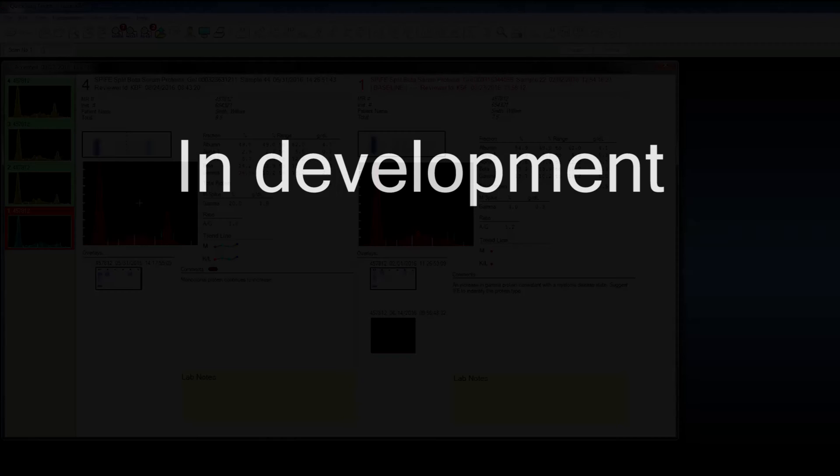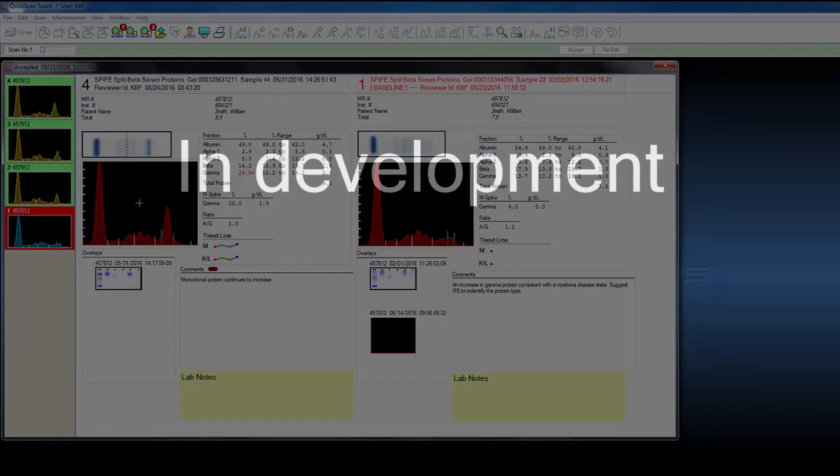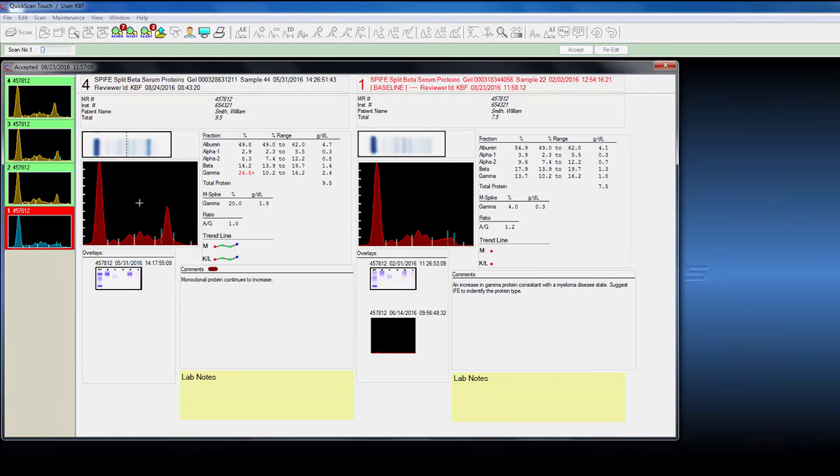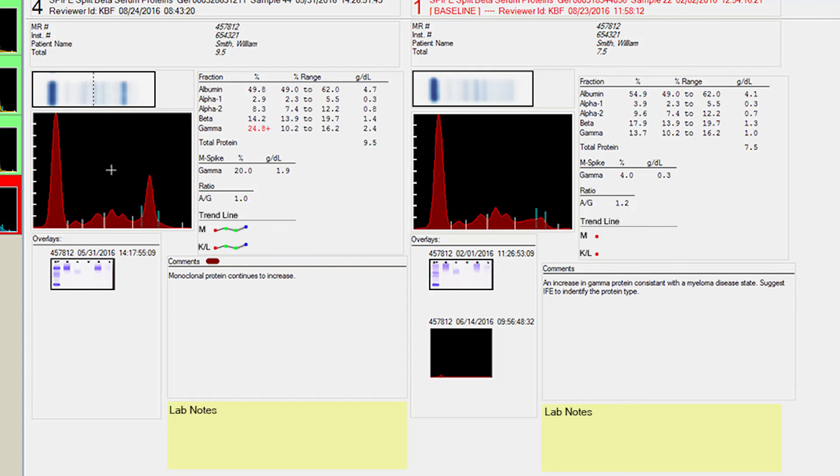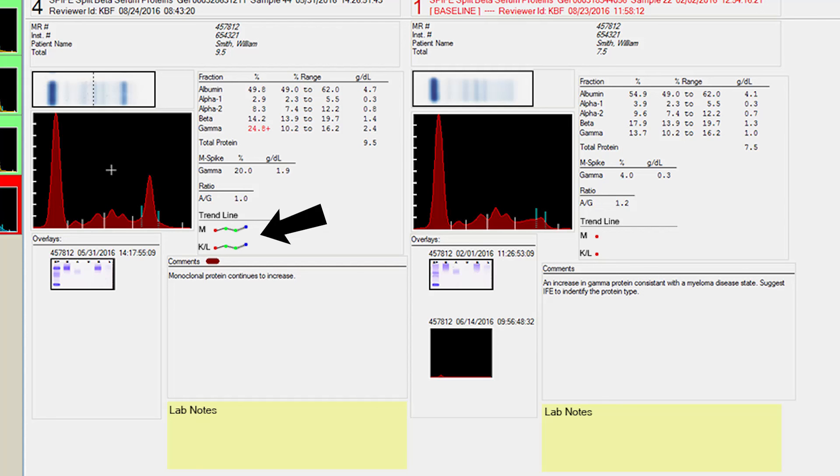A couple of features that I want to point out that we're going to add in the very near future. One of them, probably very important, since we have this monoclonal information, as you see, we're going to plot a line graph of that monoclonal protein. So the pathologist can quickly look to see if that line graph is decreasing or if it's increasing as a quick view of how the patient is responding to therapy. We're going to do the same with a kappa-lambda ratio.